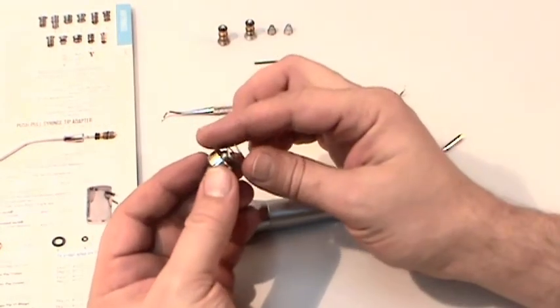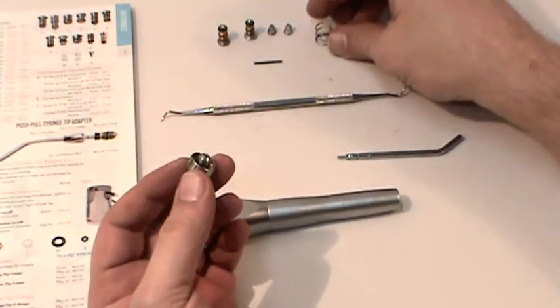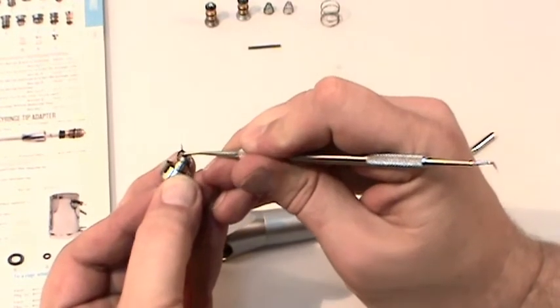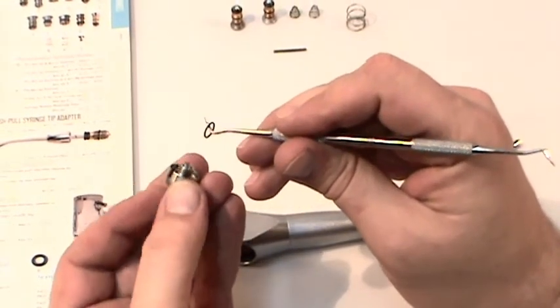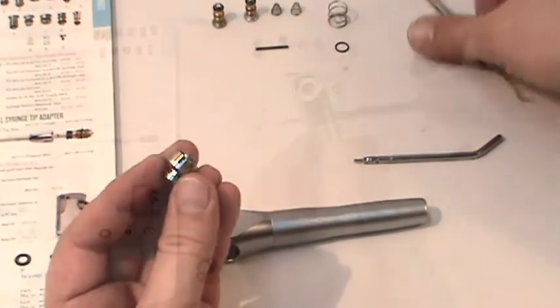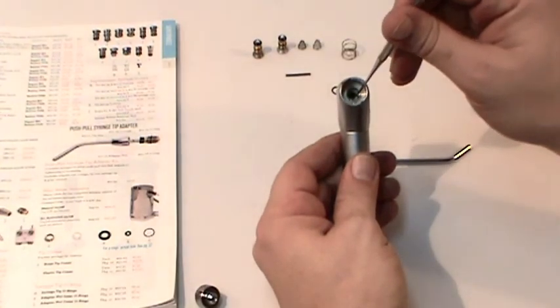Once the collar assembly and the collar spring have been removed, take your scaler and remove the skinny O-ring from the threaded portion of the collar assembly, just like last time. Don't forget the small O-ring that sits behind the assembly in the head of the syringe.